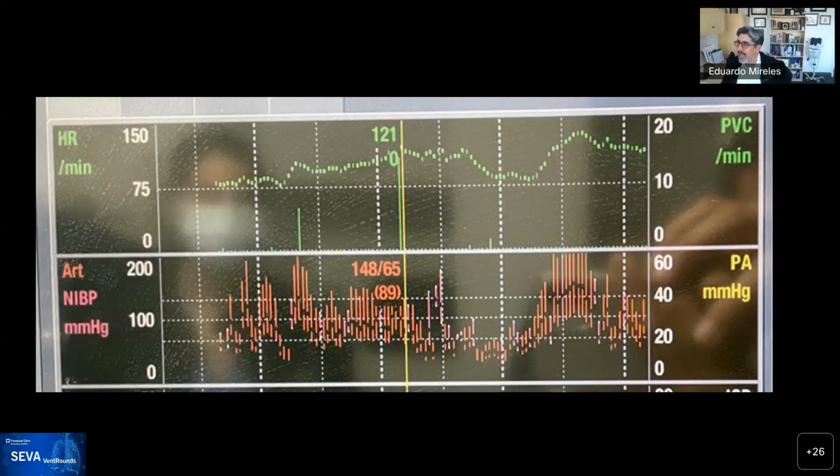So it did have an effect, but this was just too much. So it was a mechanical issue. At the moment that we advanced the extended length trach distally, it solved the problem. But sometimes the obstructions are not removable or bypassable, and without a doubt, an increase in the radius or diameter will help you. Great question.